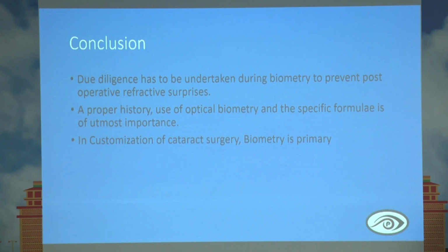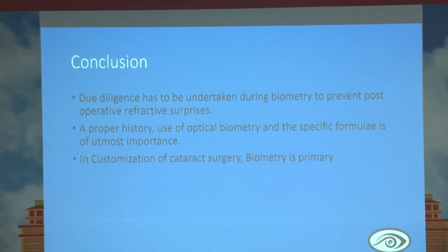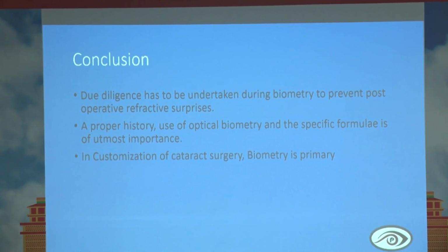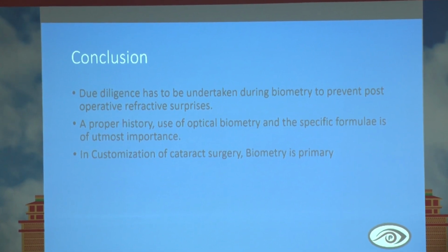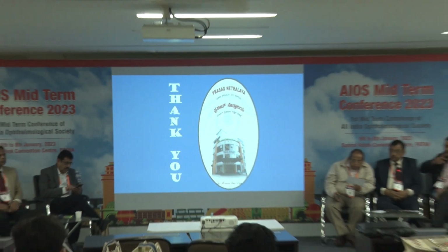In conclusion, due diligence has to be undertaken during the biometry to prevent post-operative refractive surprises. A proper history, use of optical biometry and also a specific formula are of utmost importance. In customization of cataract surgery, biometry is primary. Thank you, and all, for the opportunity.